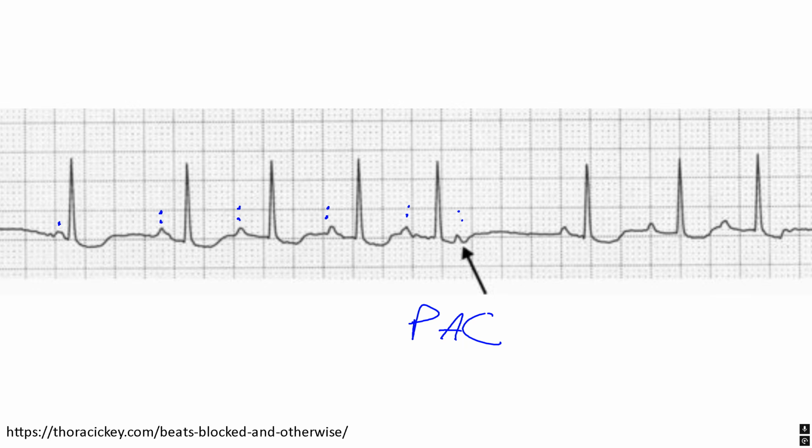When you see one P without a QRS, look at the P to P interval and the PR interval. If the P to P interval is changing, it's a PAC. If the PR interval is changing, it's a second degree type 1. If the PR interval stays the same, it's a second degree type 2.